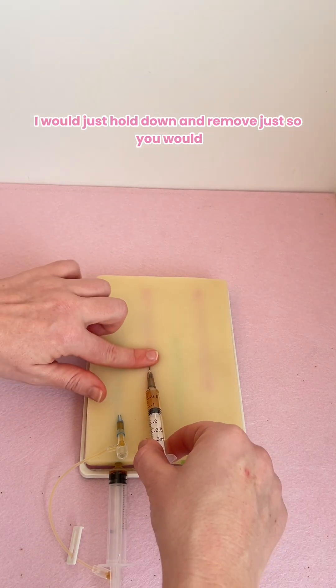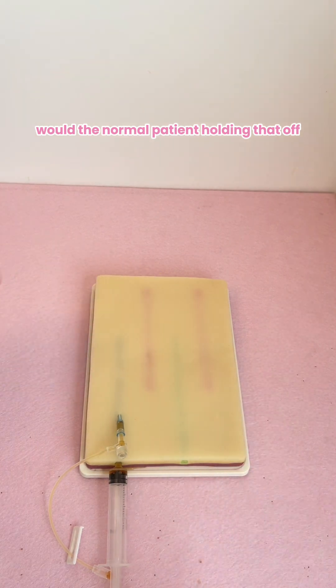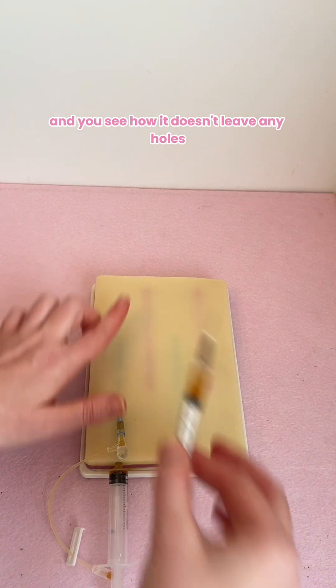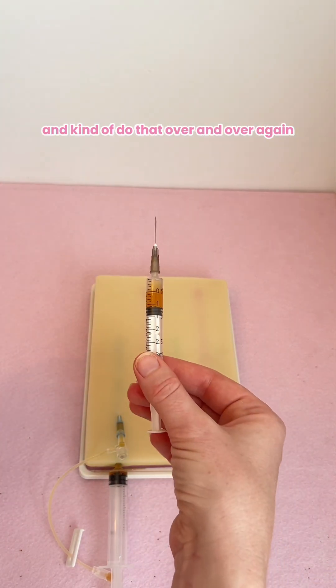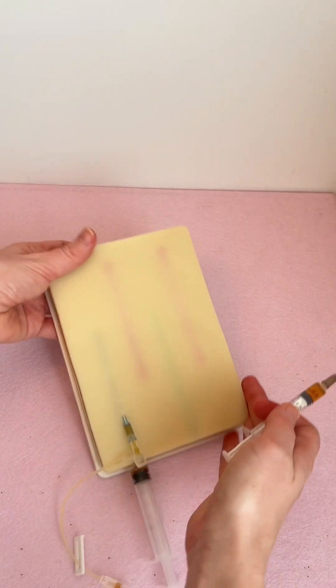To remove, I would just hold down and remove, just like you would with a normal patient, holding that off. And you see how it doesn't leave any holes, so you can go back and do that over and over again. And there is our blood sample — that's cool.